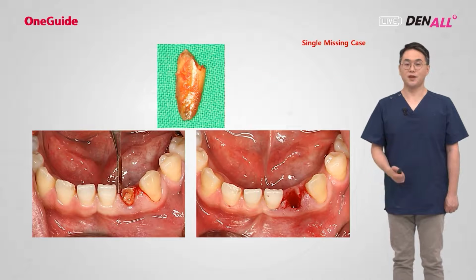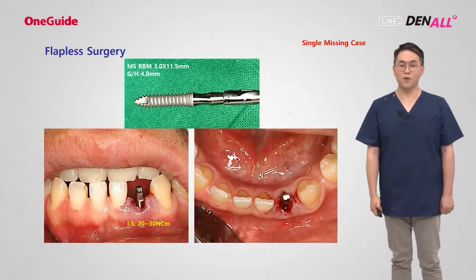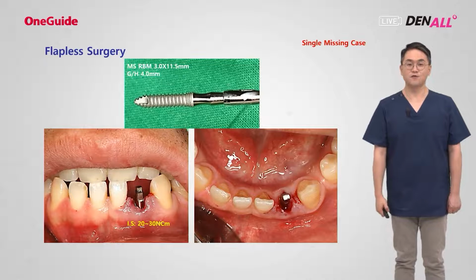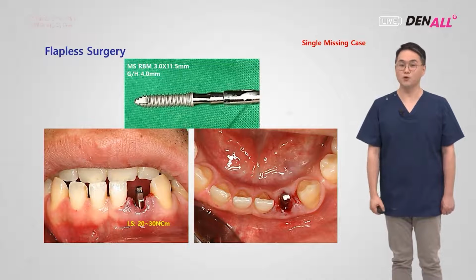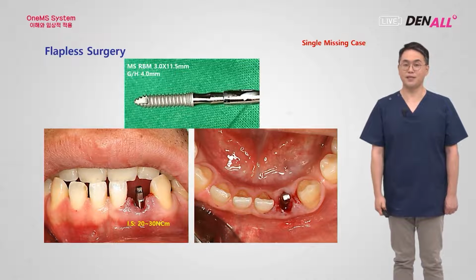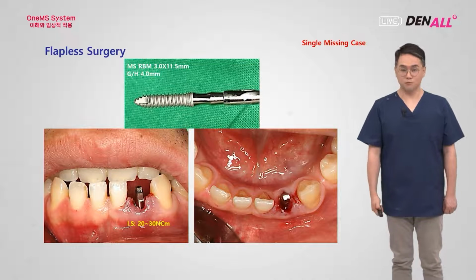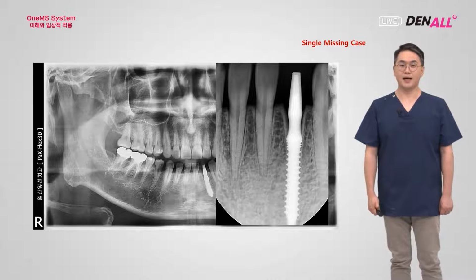I carefully extracted using Periotome atraumatic extraction, and then used this implant where the gingival height was 4.0. So again, this is the MS implant. Initial stability was okay, about 30 newtons. And these are the photos.